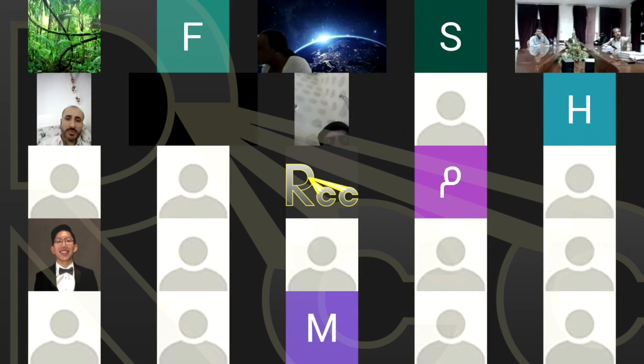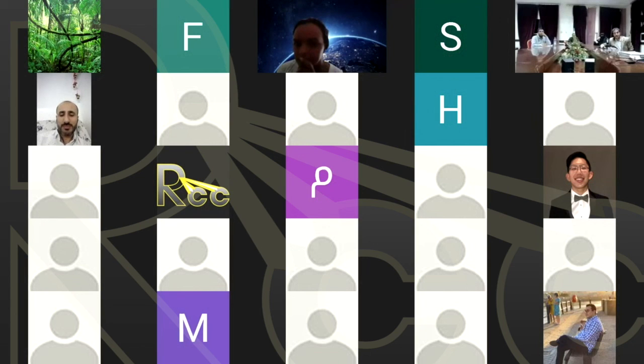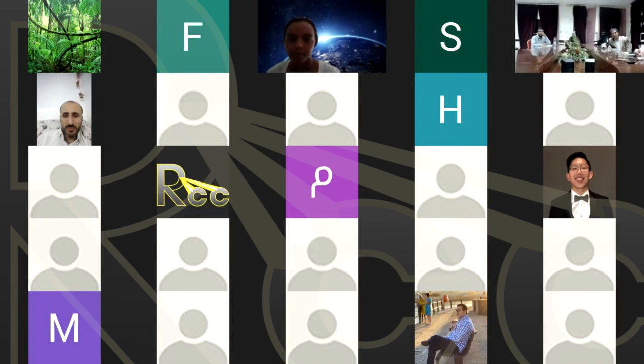Why is the image in beam view less accurate than the simulator? Do you mean the image in beam's eye view is less clear? Yes, this is a physics principle. In the simulator you're seeing bone, right? With the simulator you see the bone more. But the beam's eye view is 6 MV. It depends on the density of electrons. No, this is a physics principle. So a simulator is low keV, so you have the photoelectric effect. Bone has a higher probability of interaction when you have low energy, right? At high energy, all tissues have the same probability of Compton interaction, whether bone or otherwise.